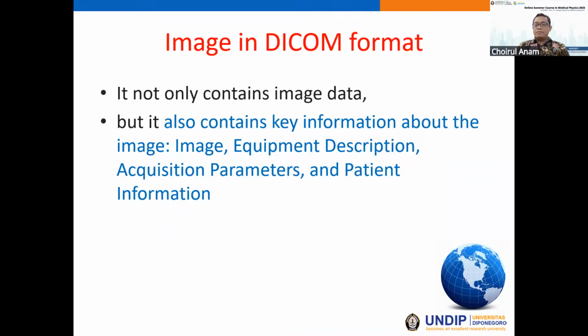In the DICOM format, the file contains not only the image of the patient, but also key information about the image, such as the equipment description, acquisition parameters, patient information, physician information, and so on. So much information is stored in the image itself.